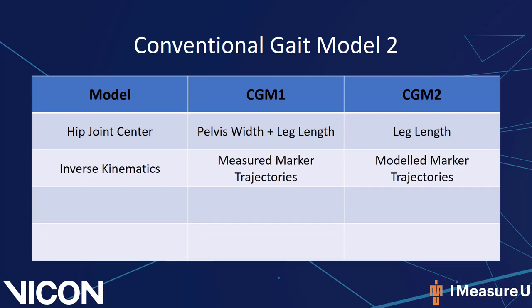Second is the inverse kinematics, or IK model. This technique fits a model by minimizing the weighted mean squared difference between the trajectories of the measured marker and the modeled marker. Simple joint constraints are also imposed to ensure that joints do not detach. In contrast, Plugin Gait uses direct pose estimation for modeling. That is, it uses at least 3 markers per segment to provide pose information for each segment. It is argued that IK is a more true representation of a biomechanical model.